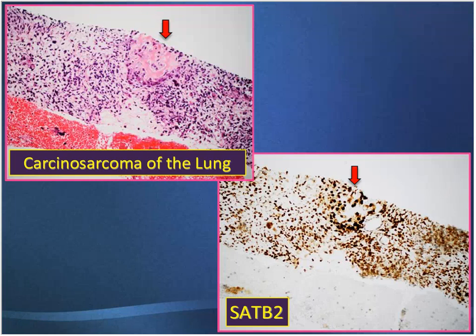So not having too many markers for osteosarcoma, this may be very helpful for that differential diagnosis, unrelated to colorectal cancer.